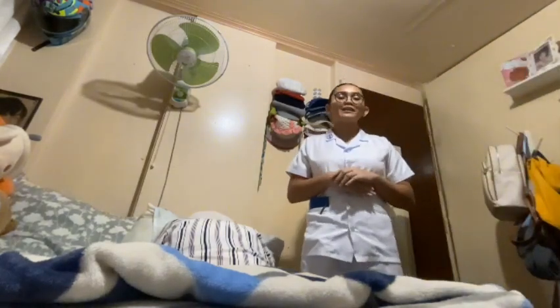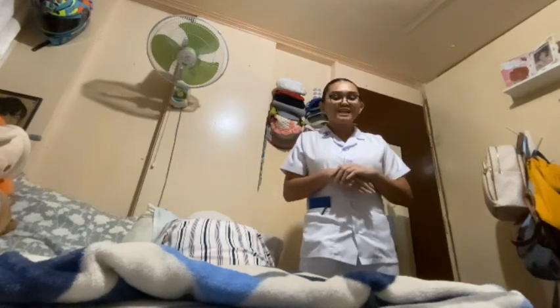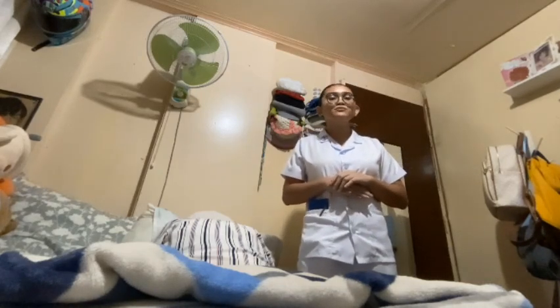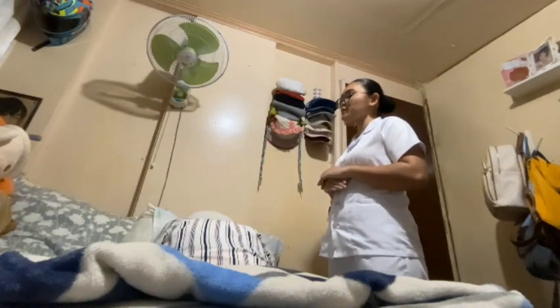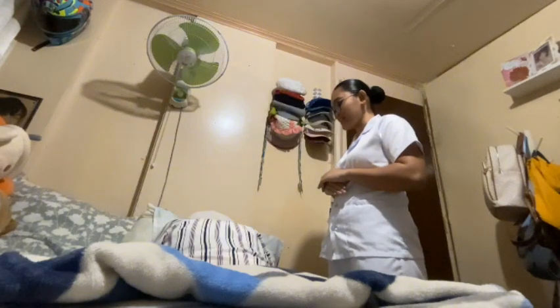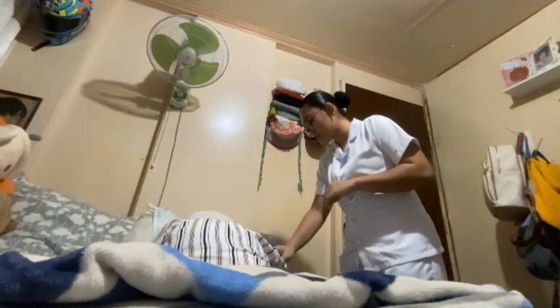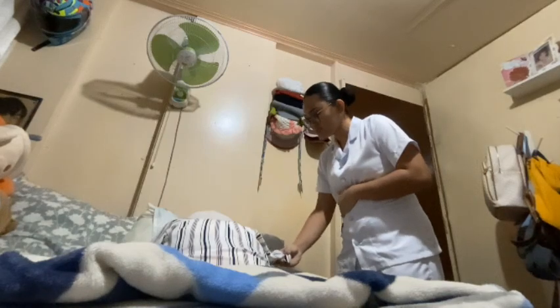Okay, next, identify the patient and explain the procedure because this ensures correct patient safety and helps reduce anxiety while gaining cooperation. Good morning, ma'am. I'm Daniela Villancero-Manilios and I will be your student nurse for today. Can I please check po for your identification bracelet to confirm your identity? Okay, thank you. Can you please state your full name, ma'am? And your date of birth? Okay, thank you, Ms. Rojas.